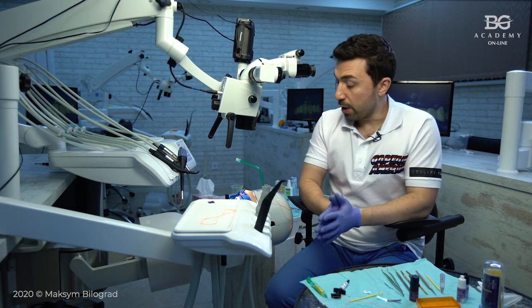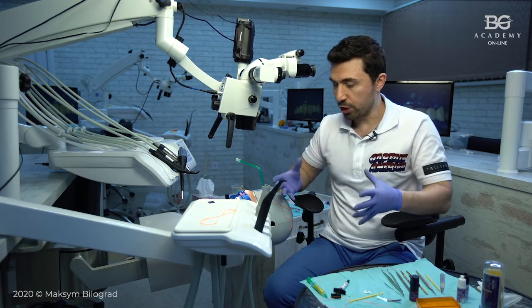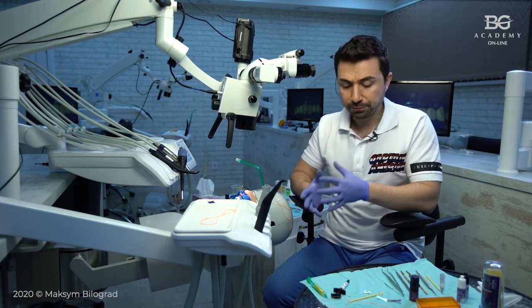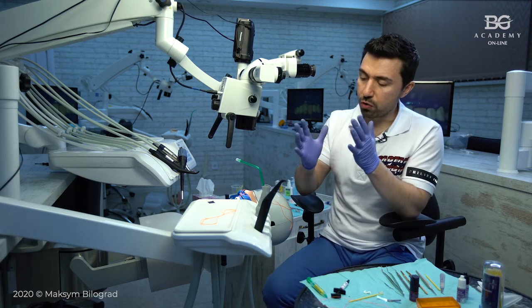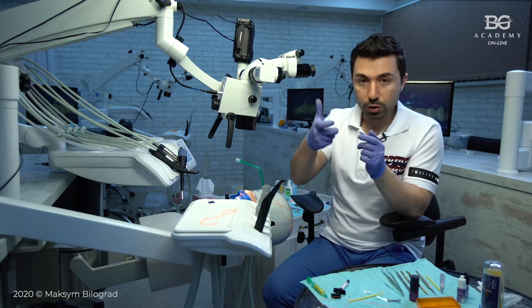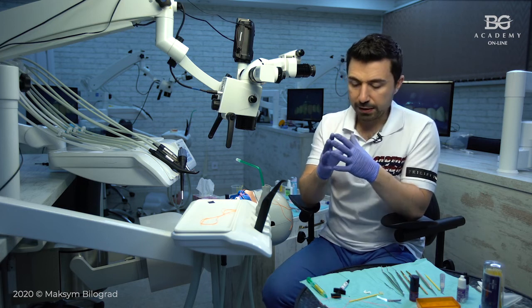Another thing, if you have your dentin fresh now, you sandblast, you didn't make your IDS, and you prepare your tooth surface right now, including dentin, what theoretically may happen is when you get your composite resin or resin cement with your veneer, and then you light cure, there is a shrinkage of the material.